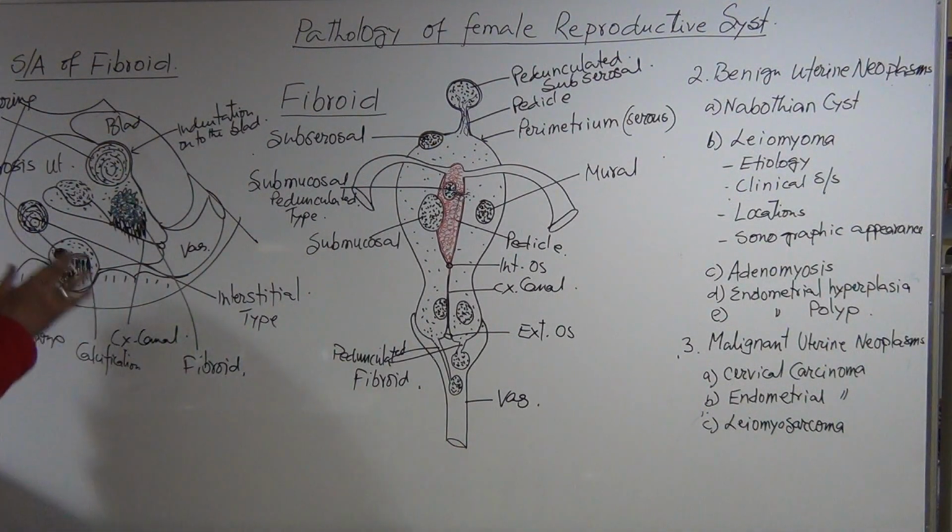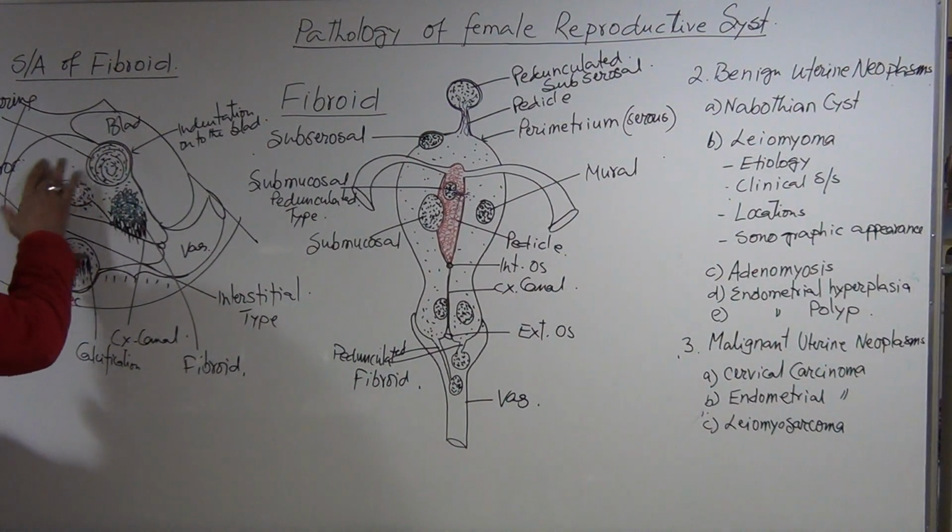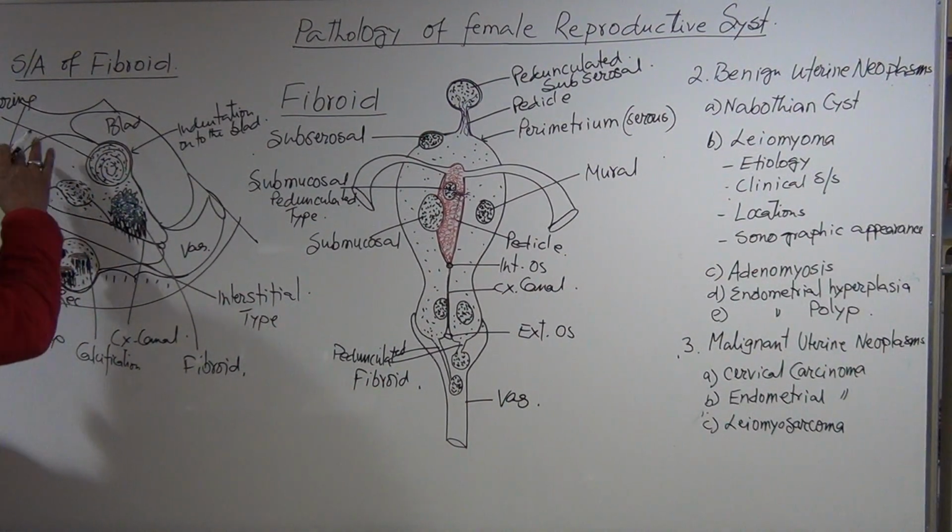Okay? If one of the fibroid is here, just understand that.